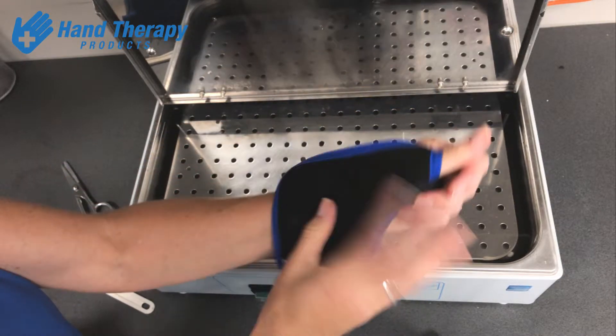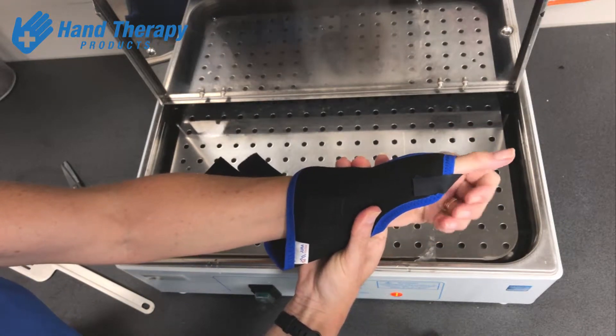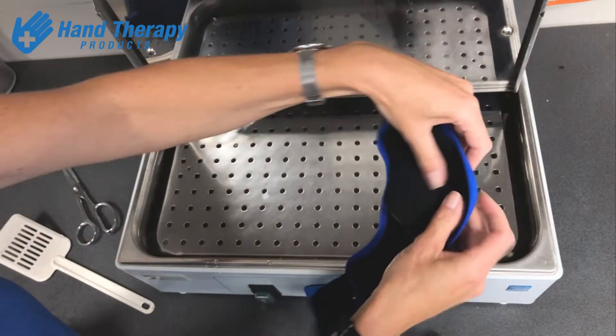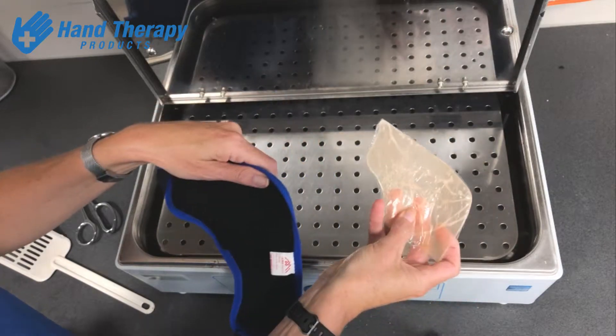That way, once you've molded the splint onto the client, if you want to change it at any point you can remove the whole piece of plastic in its liner and remold it again.